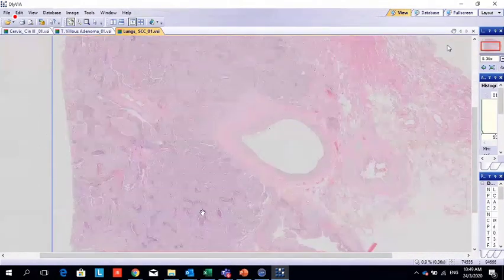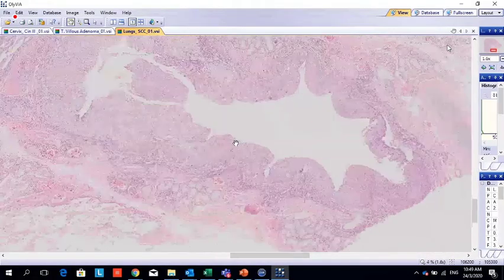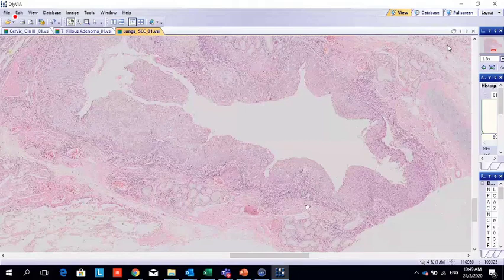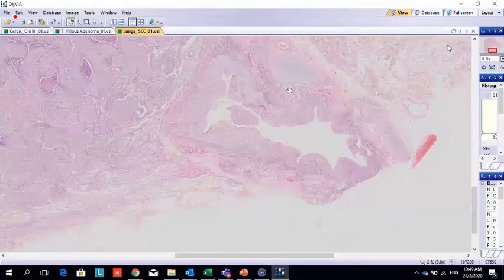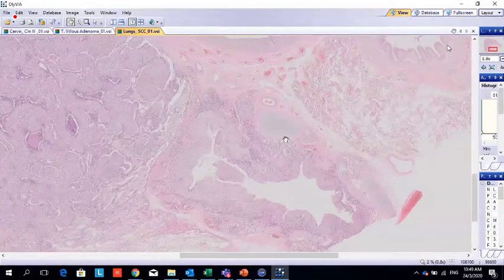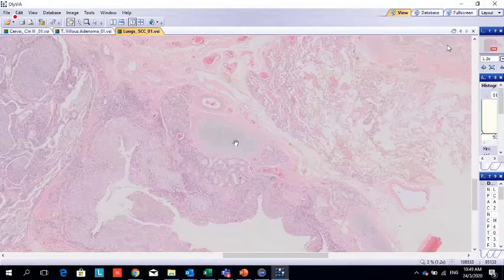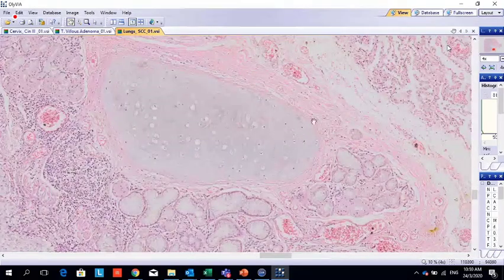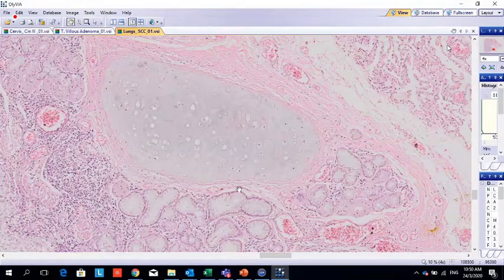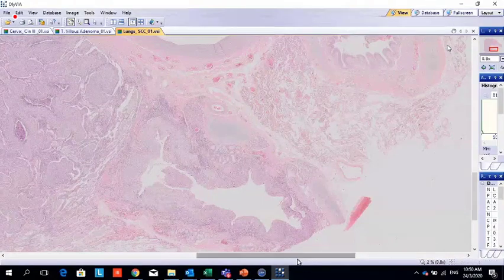Okay. So what do you think? Lesion where? Started where? Can you see this area? This area is what? It is a bronchus. Look at here, the bronchus. This is the collagen fiber. Not collagen, sorry, what you call cartilage. When you see cartilage in the bronchus, okay, cartilage. So this is a bronchus. Can you see? This is a bronchus.